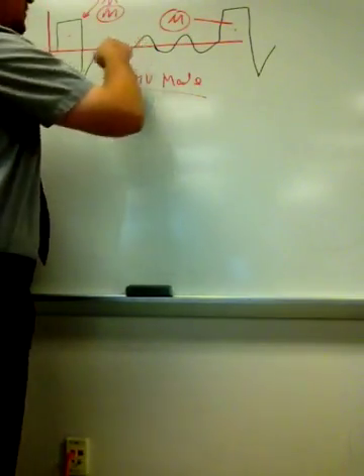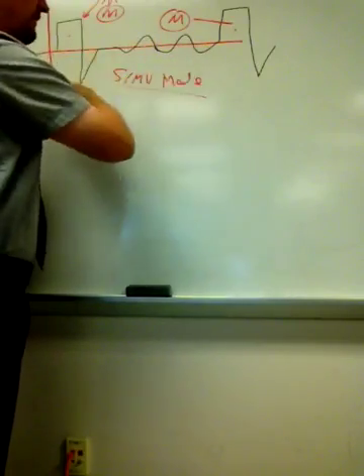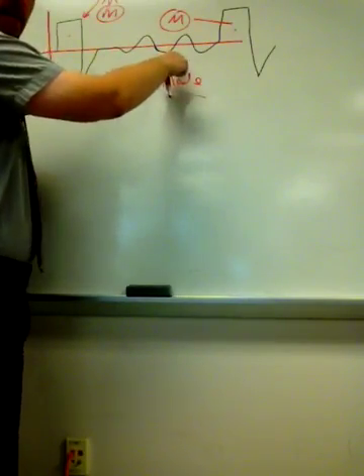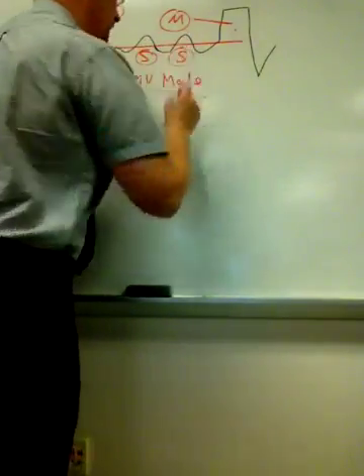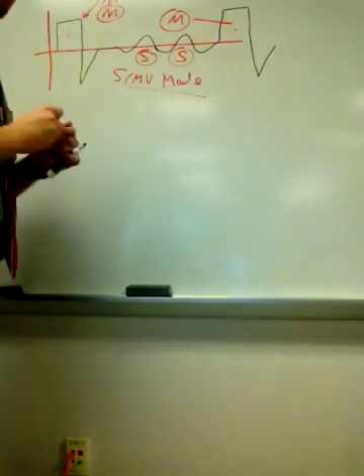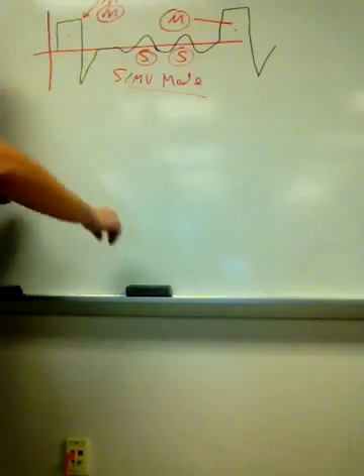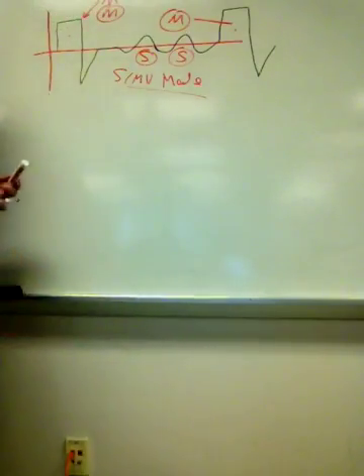And then in between these two mandatory breaths, I have my sine, or what looks like a sine wave, and of course these are spontaneous breaths. So we can identify when somebody is taking spontaneous breaths on our flow time scaler, and we can also help identify the mode.